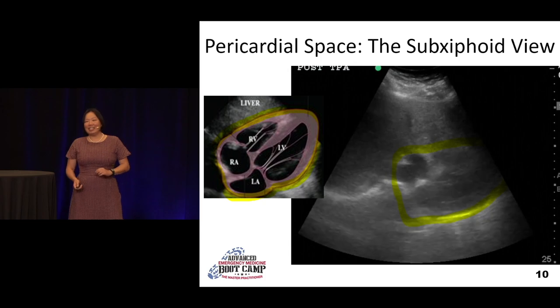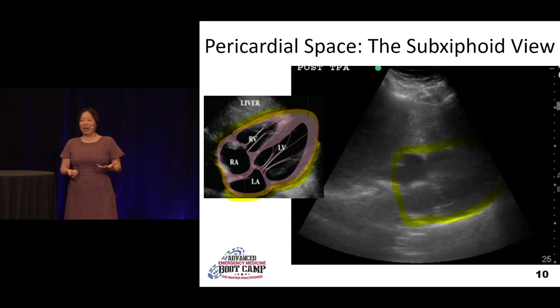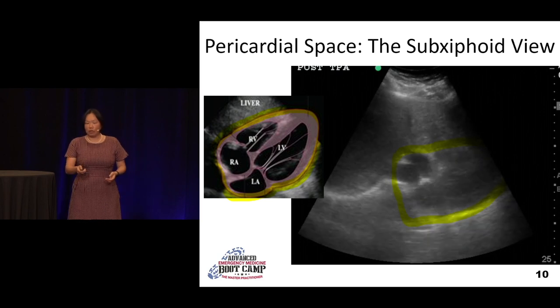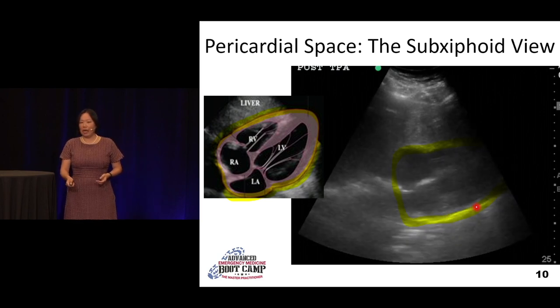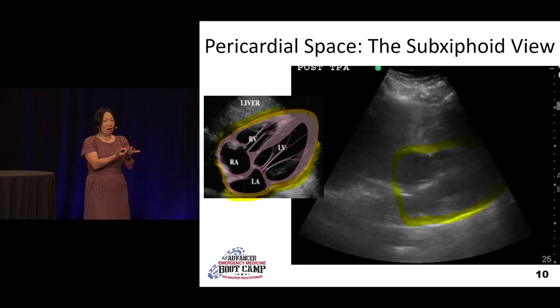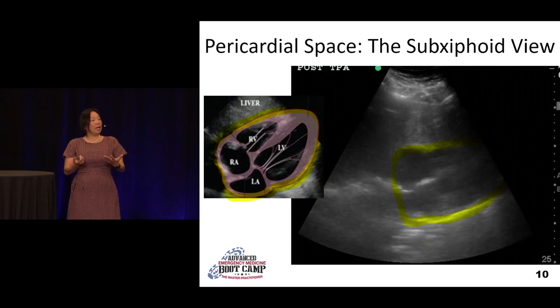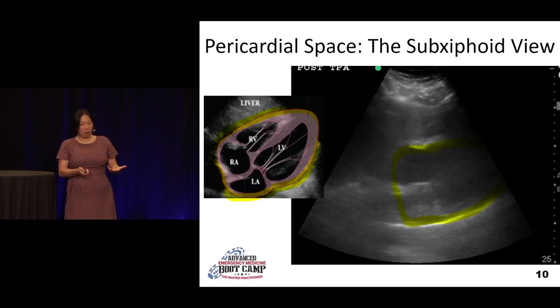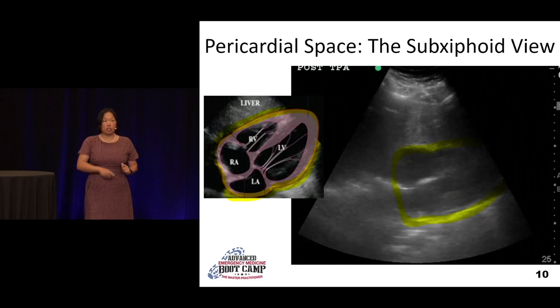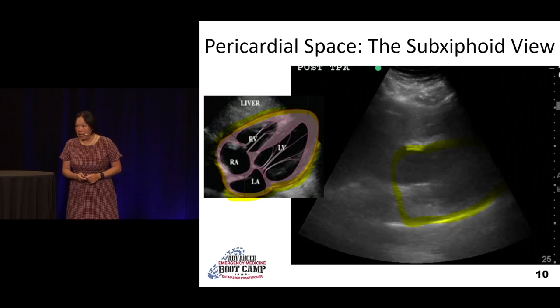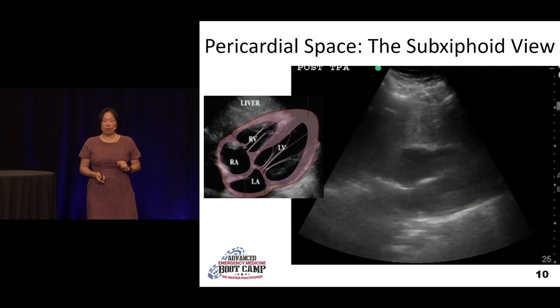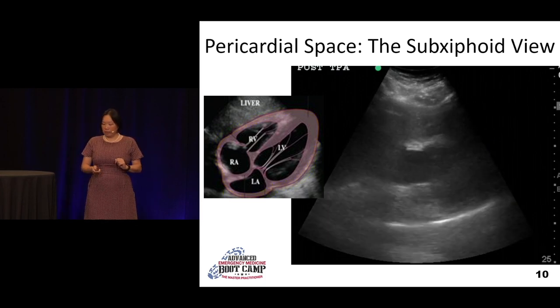This is the heart. We're going to go through it just so you know you can see it's beating, and your pericardium is the covering of the entire heart — it's highlighted in yellow here. That's where we'd be looking for a stripe of black space if there's a pericardial effusion.